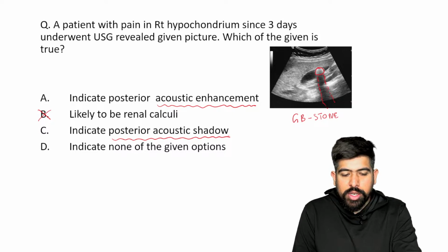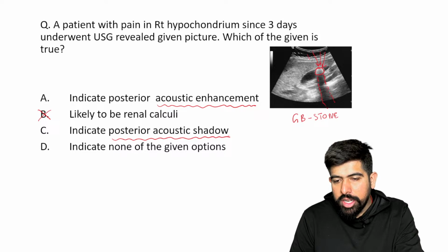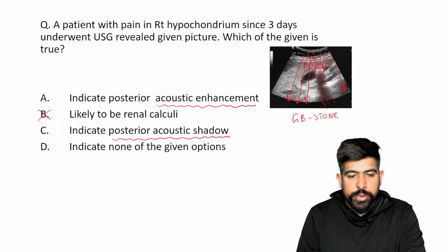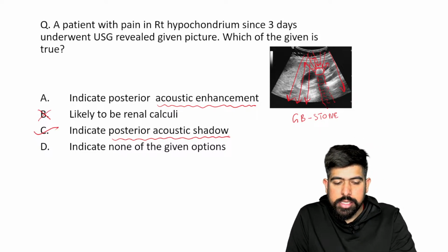Yes, very good, doctors. I already showed you, this is shadow. This is the probe. From here, the ultrasound waves are coming, they strike it and return back. But what about this condition? Here the ultrasonic waves are not returning, they are going directly through. So that's why in this area the acoustic shadow is seen. As the acoustic shadow is seen, option C is the correct answer for this condition.